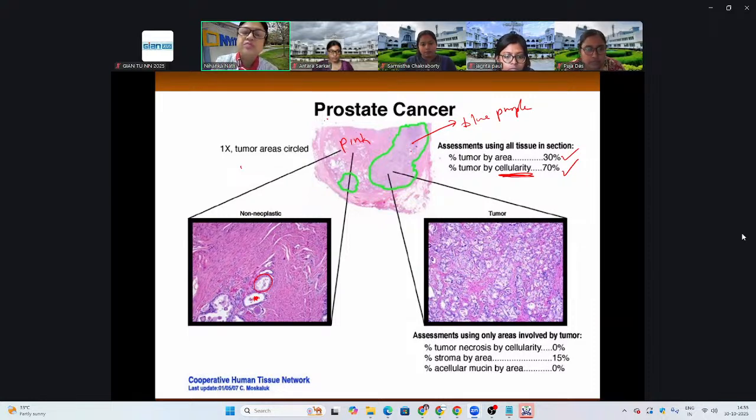When cells multiply fast, they don't have time for all that cytoplasm. So based on this, they have taken sections from here, and then they took sections from here as well, from the pink location.